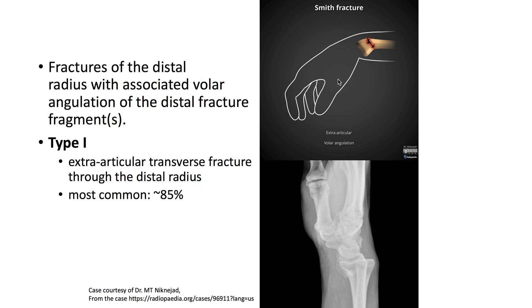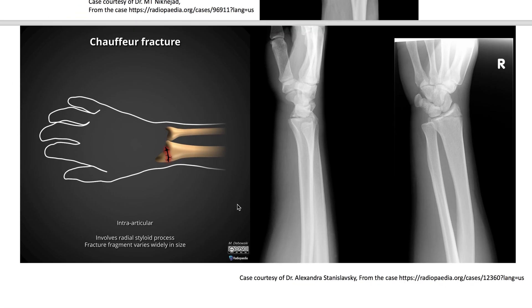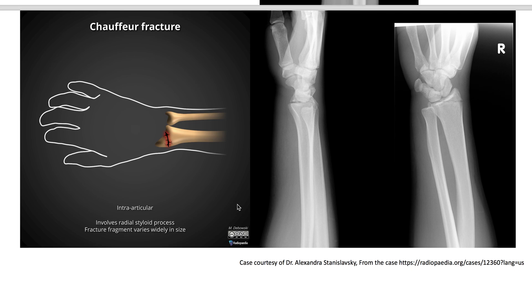A Smith fracture is a fracture of the distal radius with associated volar angulation of the distal fracture fragments. Type 1 is extra-articular and is the most common. A chauffeur fracture is intra-articular and involves the radial styloid process; the fracture fragment varies widely in size.